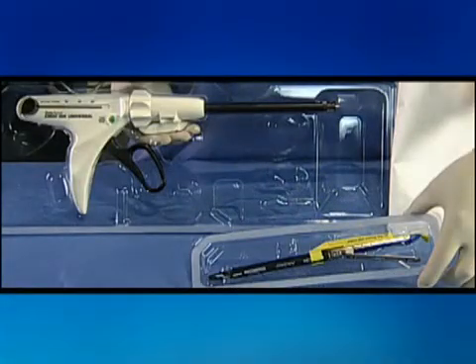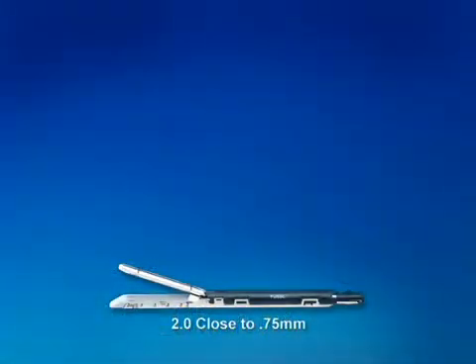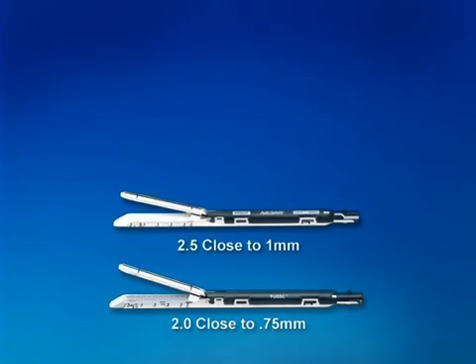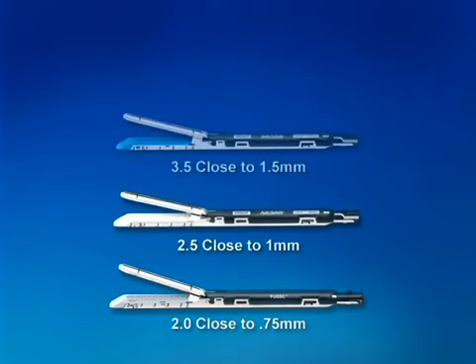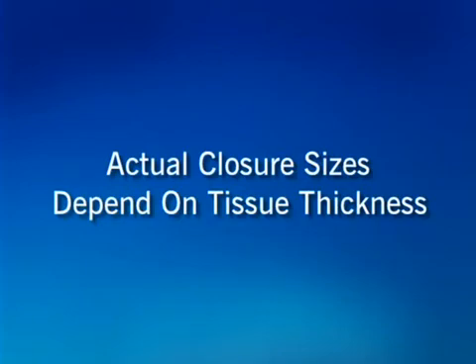The EndoGIA Universal Stapling System instruments and loading units are packaged separately in blister packs. Loading units are color coded according to the size of the staple. The following staple closure sizes are estimates: 2.0 staple sizes are gray and close to 0.75 millimeters; 2.5 staple sizes are white and close to 1 millimeter; 3.5 staple sizes are blue and close to 1.5 millimeters; 4.8 staple sizes are green and close to 2 millimeters. Actual closure sizes depend on tissue thickness.